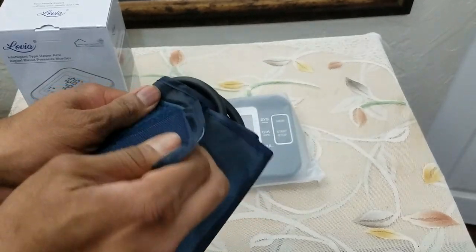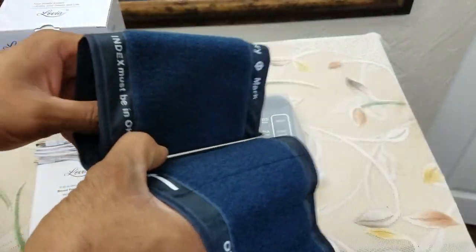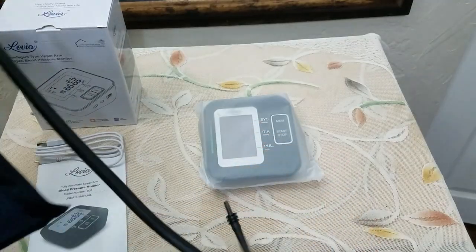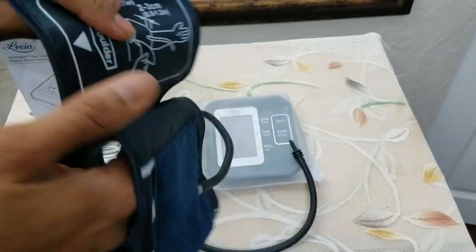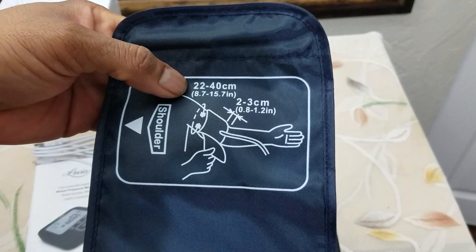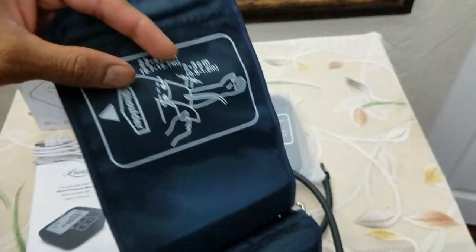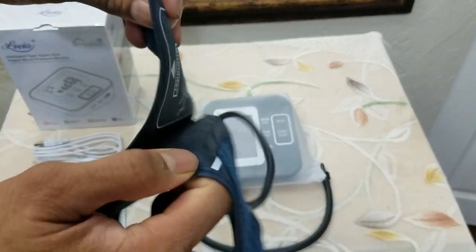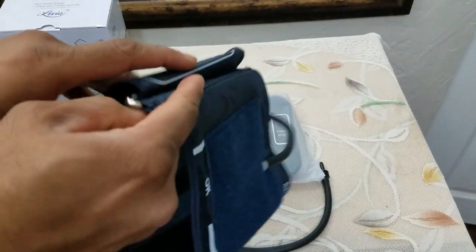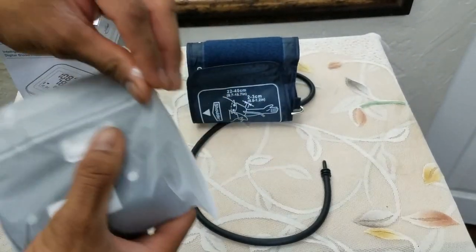This is very good velcro. I definitely like the fact that this is really thick velcro, and that is the tube. As far as the size is concerned, it can fit up to 15.7 inches in diameter, so this should be sufficient for most people.